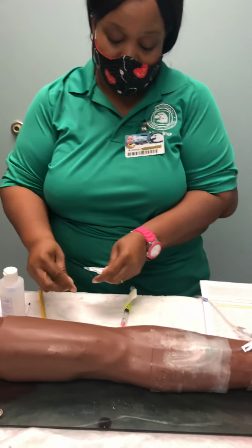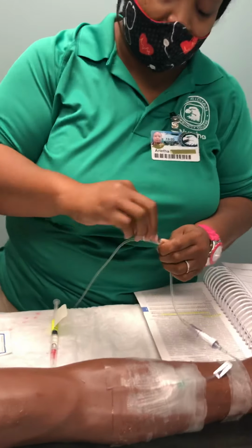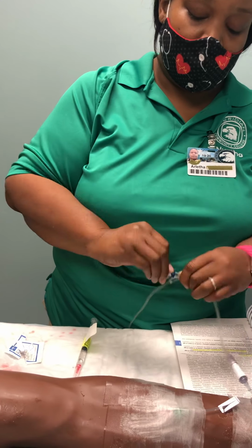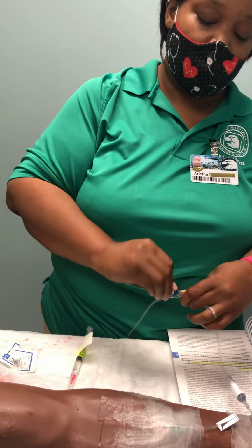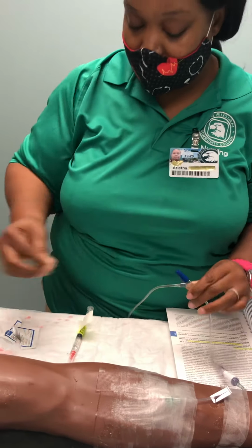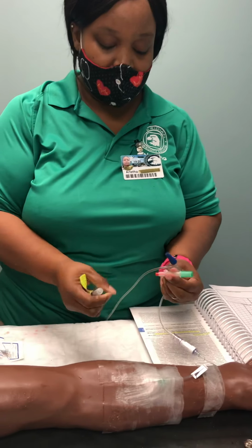I am going to clean the port closest to the patient for 30 seconds. Okay, 30 seconds. As I do that, it's time to give my medication.